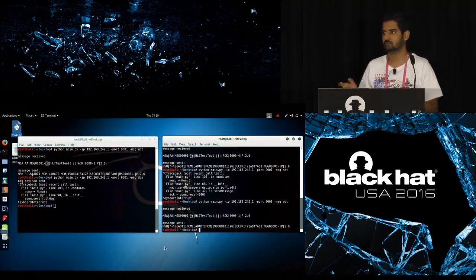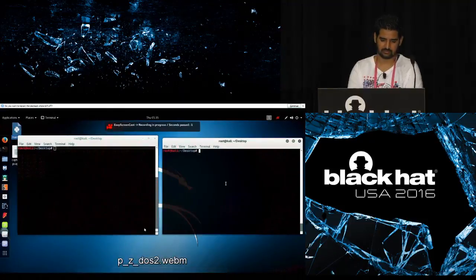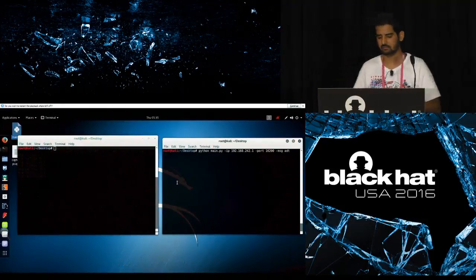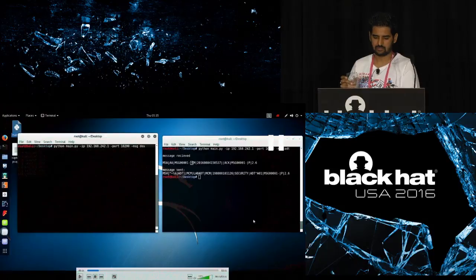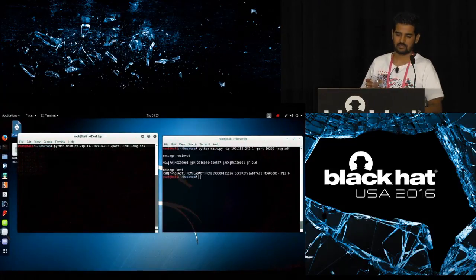This is a very small system. If you talk of large systems, what will happen is this. You send an ADT message, I know this runs ADT, and I get a response back. Look at the response. I got a response really quick, in about 1 second. Now I send a DOS.